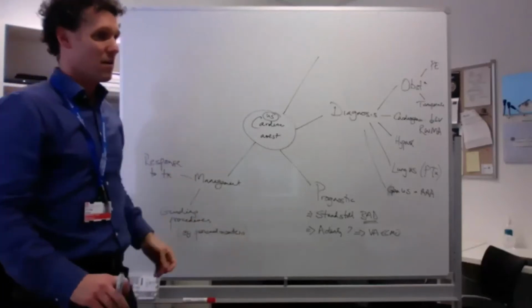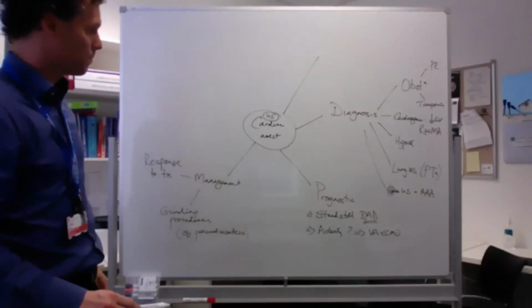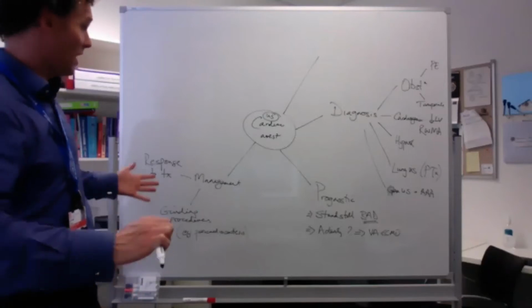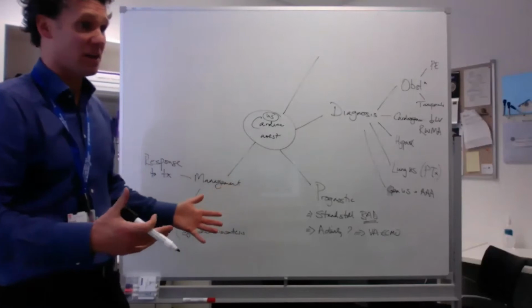I actually misinterpreted this question to think it was echo during cardiac arrest. It absolutely could be. So this is what it is.